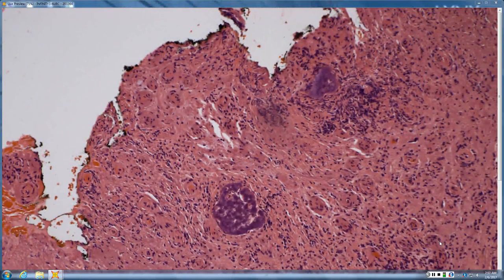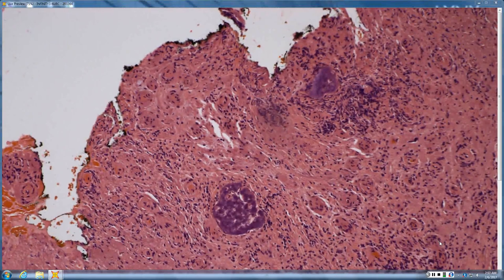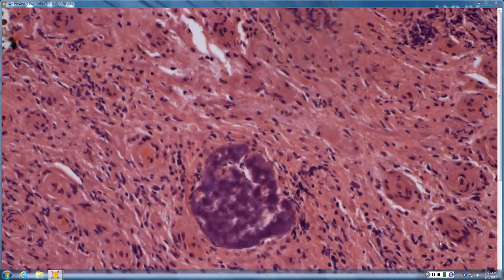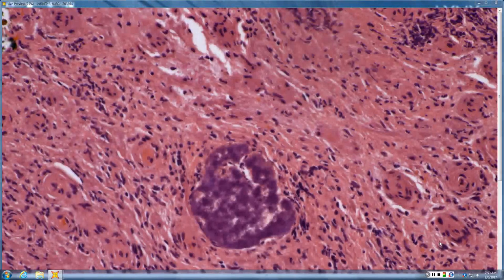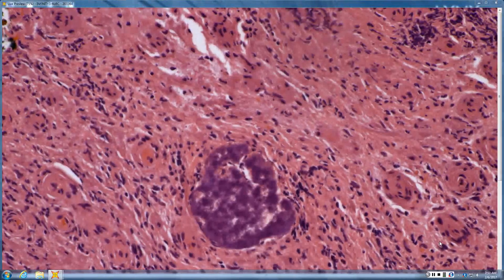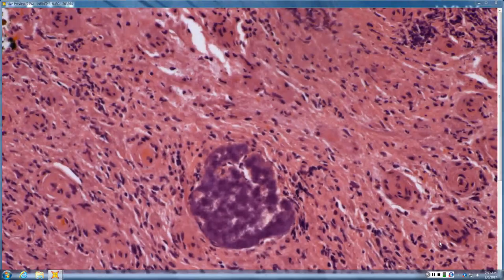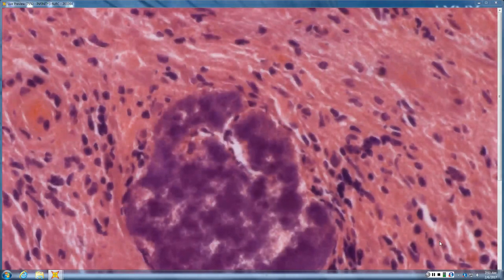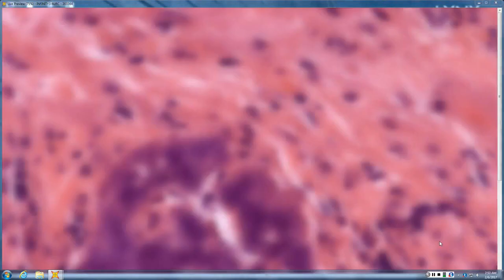Like a grain? Yep, a grain. Like a mycetoma? And so grain goes with either mycetoma or botryo. Botryo. Botryo. Right. So botryo is caused by? Staph. Staph aureus. So it's just huge staphylococcal grains. So we're going to look higher.